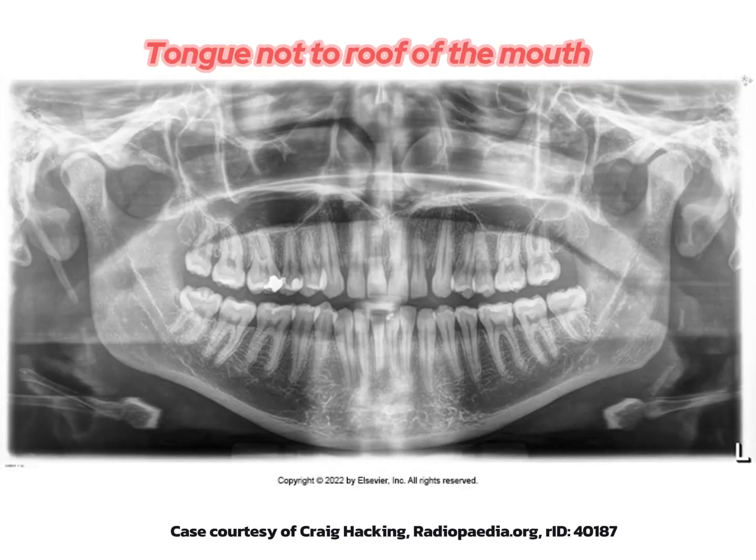Tongue not placed against the hard palate causes an air space to be visible and a soft tissue shadow. Although failure to position the tongue on the roof of the mouth is one of the most common patient positioning errors, to correct it the patient must be instructed to swallow once and to hold the tongue against the hard palate during the exposure.